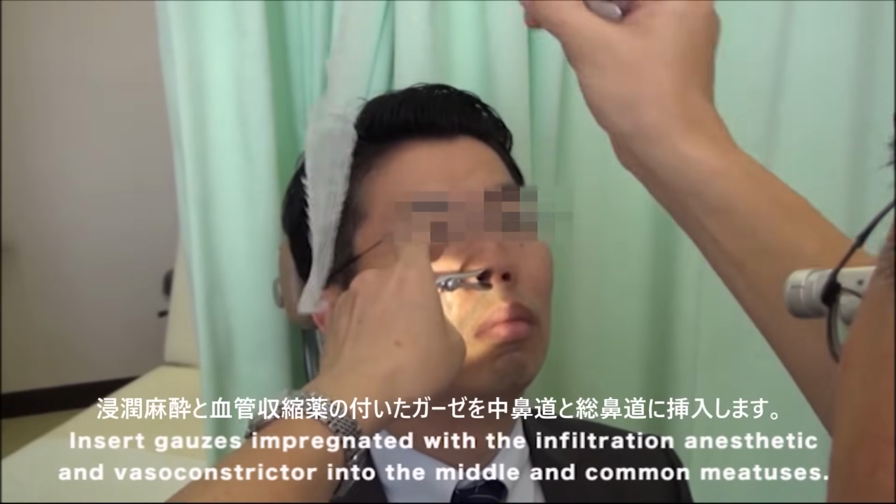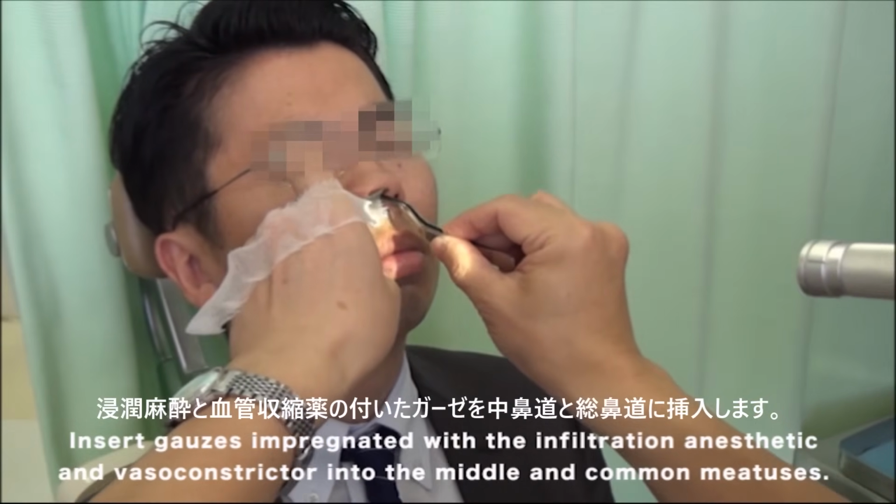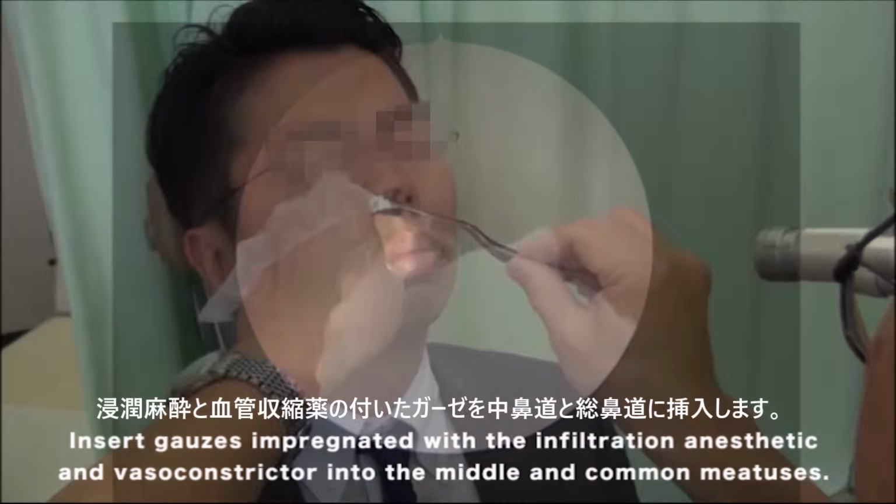Insert gauzes impregnated with the infiltration anesthetic and vasoconstrictor into the middle and common meatuses.